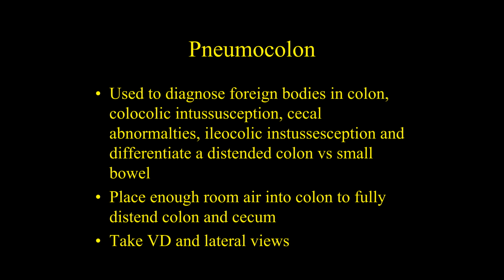Okay, again, there is no dose, and really you can't overdose them because if you fill up the colon with gas, the colon stretches out really big, and then it would just go into the small bowel anyway. So you want to give a bunch of gas into the colon and then immediately try to shoot your x-rays before the gas passes. Okay.